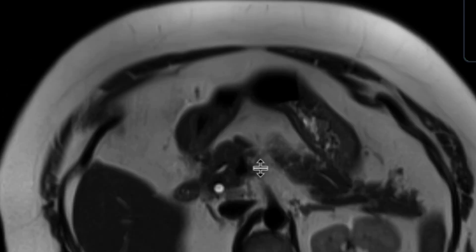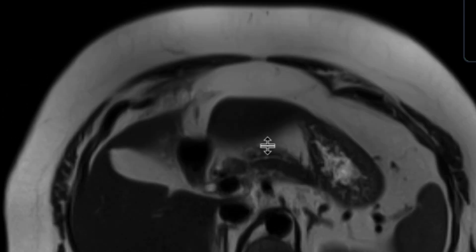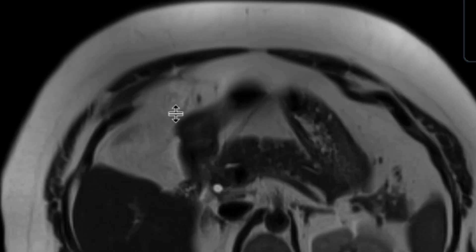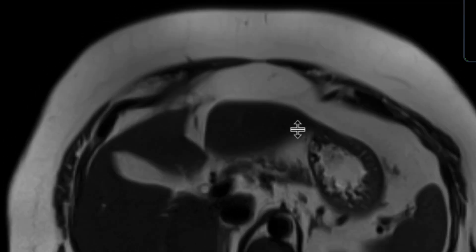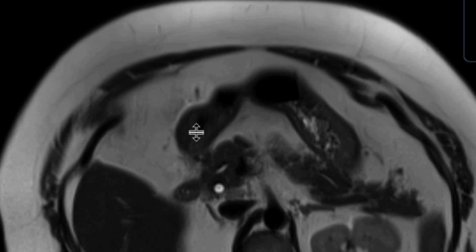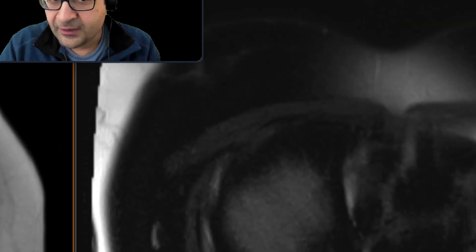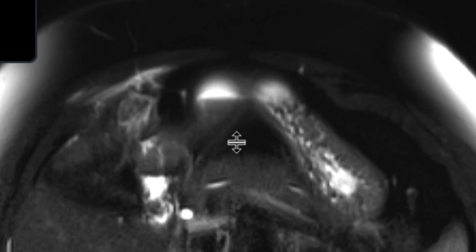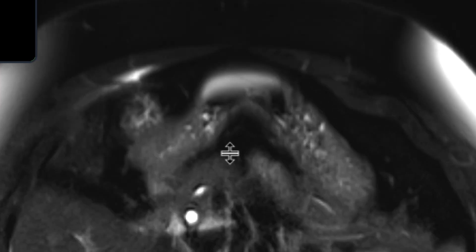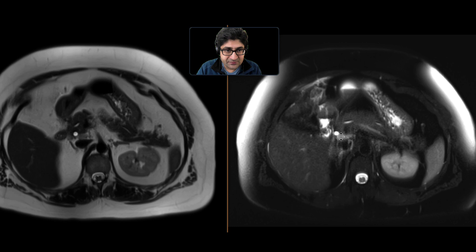However, if you look in the right upper quadrant, there's certainly a little bit of stranding going on right over here, just beneath the portion of the liver, adjacent to the portion of the duodenum, though the duodenum looks okay. We can look at these findings on our T2-FATSAT image, which definitely shows some inflammatory change right around there. You can see that some of it extends just deep to the anterior abdominal wall, so the patient is certainly symptomatic from this. The duodenum adjacent to it looks pretty okay, as is the liver.